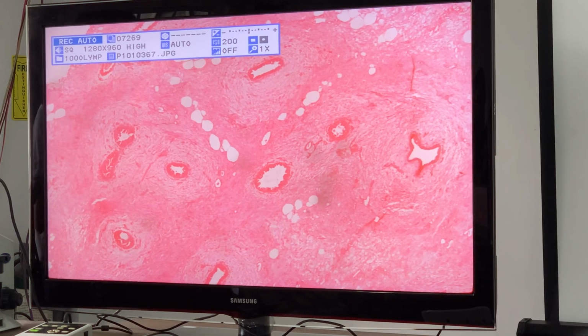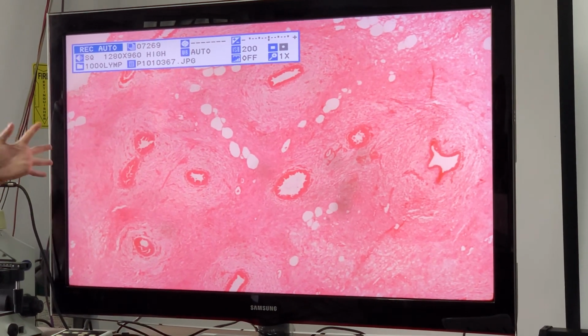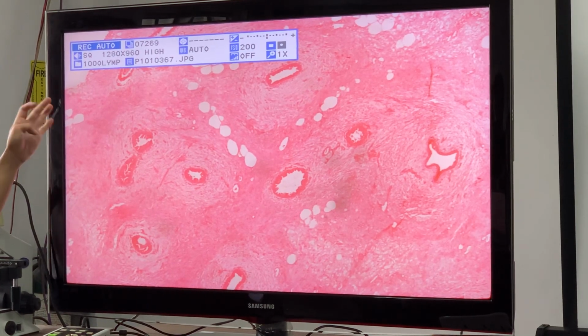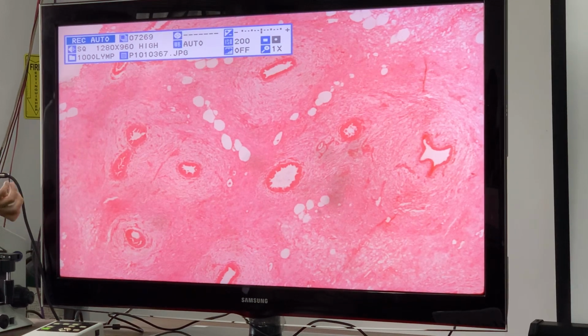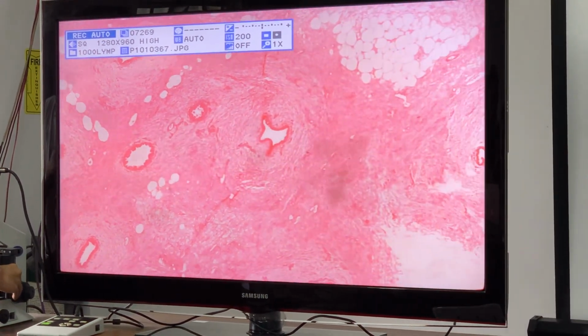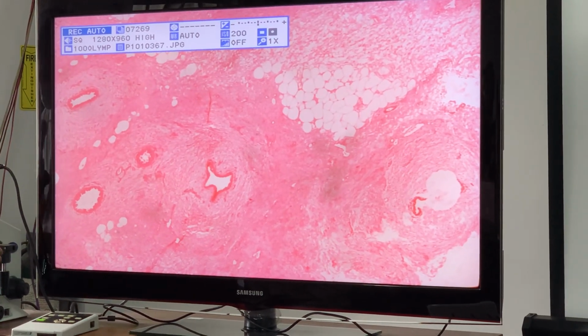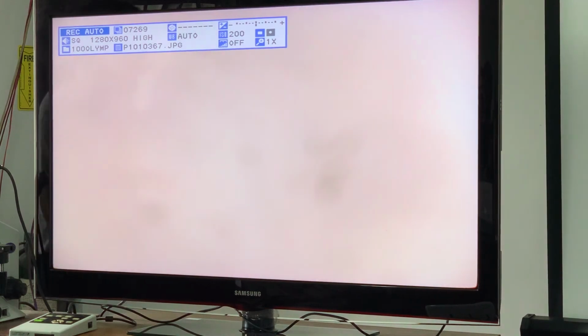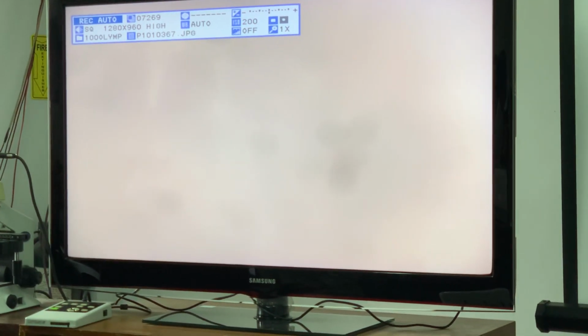Ideally these things are just supposed to be small. They're supposed to be like the female counterpart, but the exception is there are no glands. The male breast doesn't produce milk. It just has ducts. So that's kind of unusual. There's a lot of large ducts and a lot of proliferation. You don't have to know it. It's not going to come out in the exam, but just to show you.